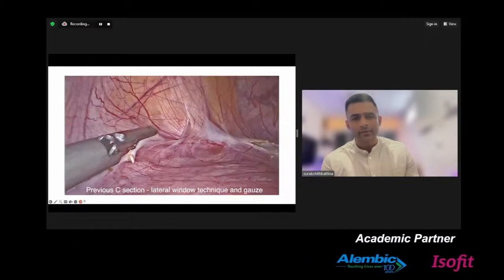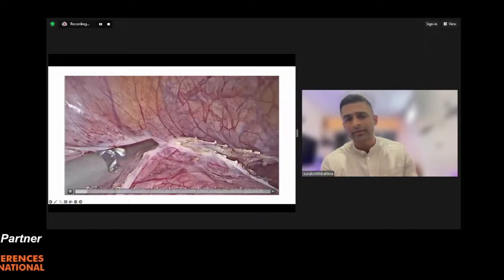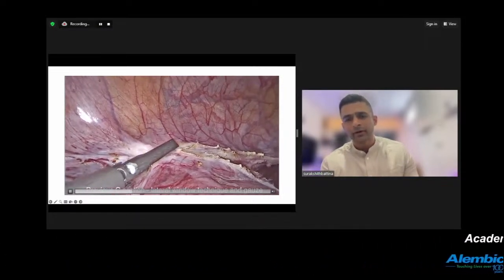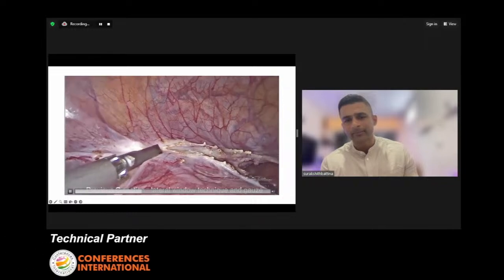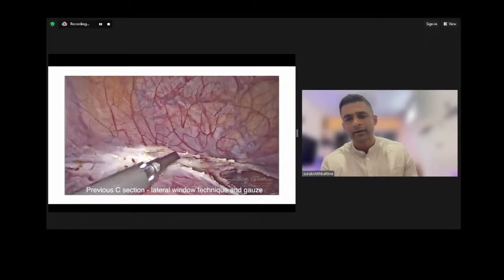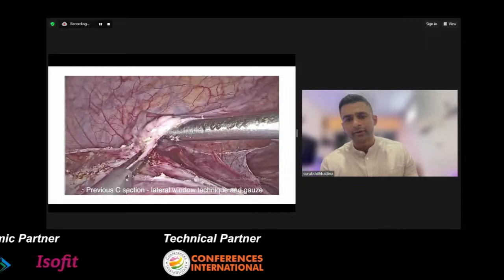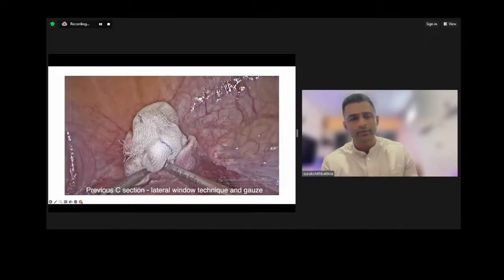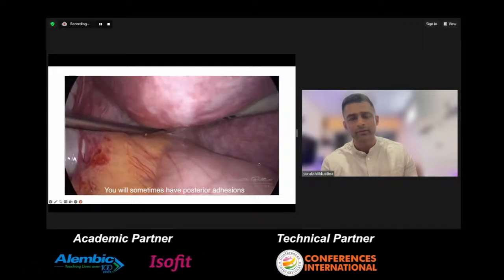So again, some of the tips I can tell you: if in case the patient has a previous C-section, always use the lateral window technique. This is going to help you to avoid any kind of bleeding or issues while you're doing it. Again, as I said, sometimes I also use a gauze. This will also help in pushing the UV fold down.